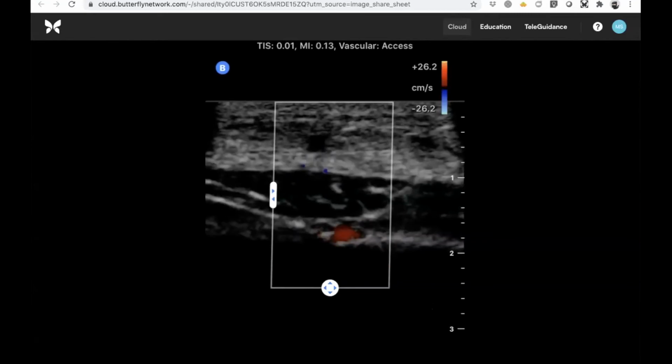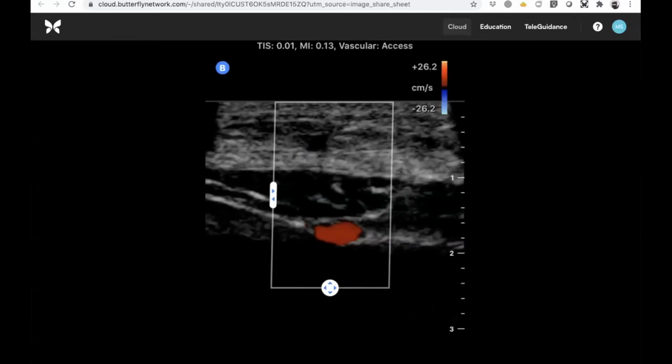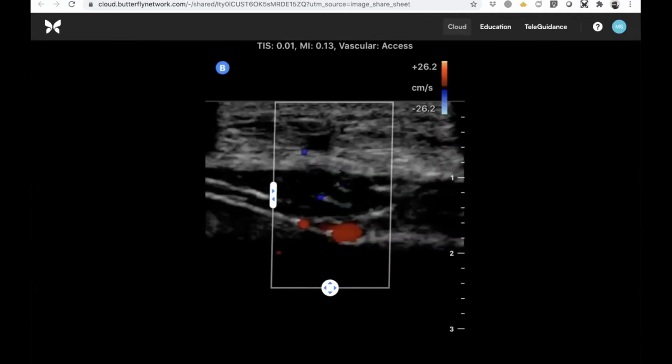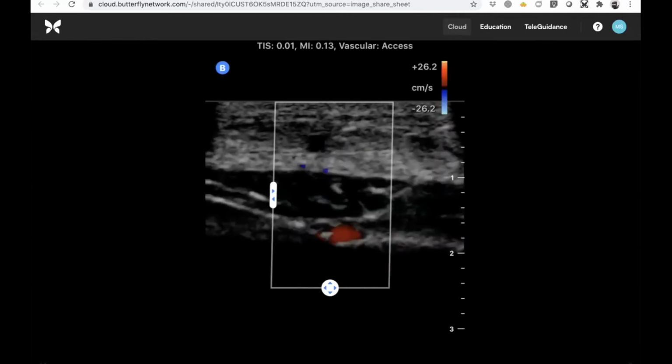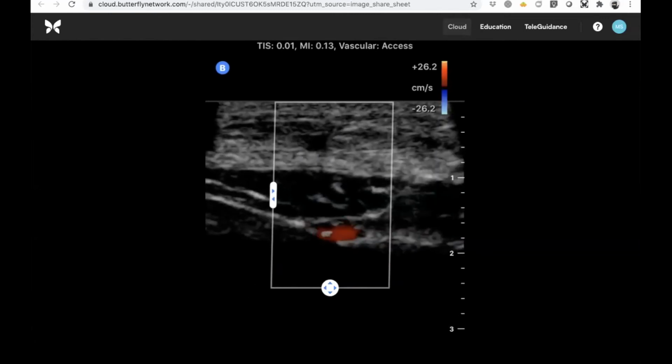You know, I actually do. And the reason being is that usually these arteries are fairly midline, but in an ascites patient, because their abdominal girth has grown, these arteries can translocate more laterally. And okay, the chances of hitting it is fairly slim, but I once did a paracentesis where we drew out frank blood, and then we were like, oh, did I hit it? And so we were freaked out for a while. And so now I just do it before every one I do.